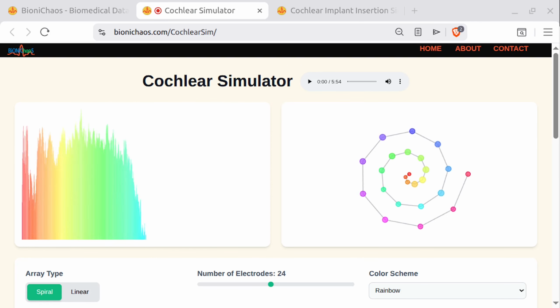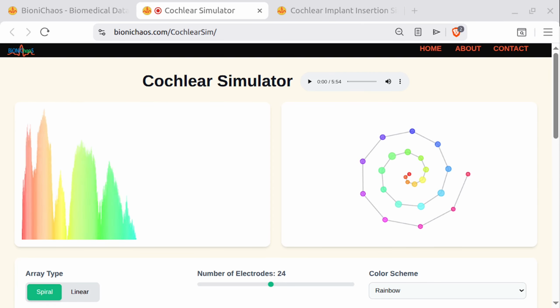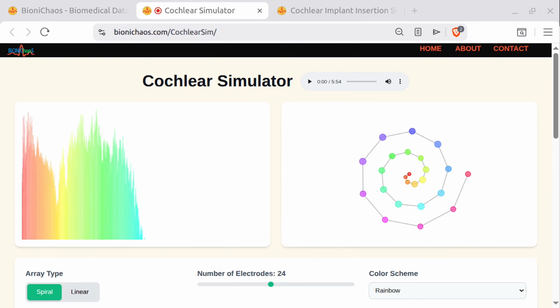Right. The aggressive push for early childhood implantation often forces the patient to straddle two worlds. They rely on a machine to function in the hearing world, but if the battery dies, they are thrust into silence without necessarily having the foundation of deaf culture or sign language to fall back on. That is a tough position. The implant forces them into a liminal space, often feeling fully integrated into neither world. I hear you. I think that highlights the incredible complexity of what we are trying to achieve.